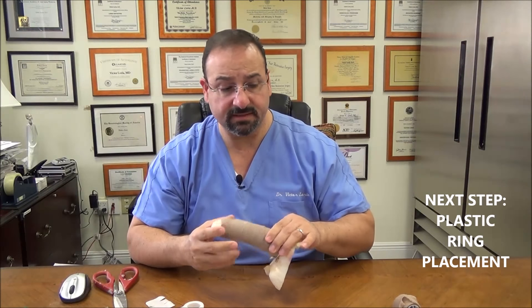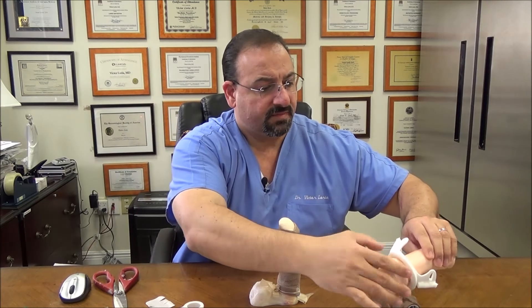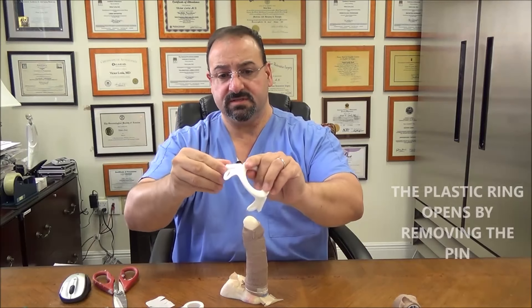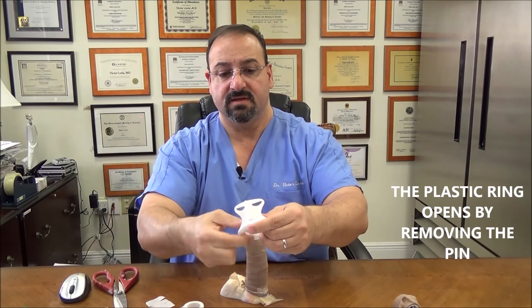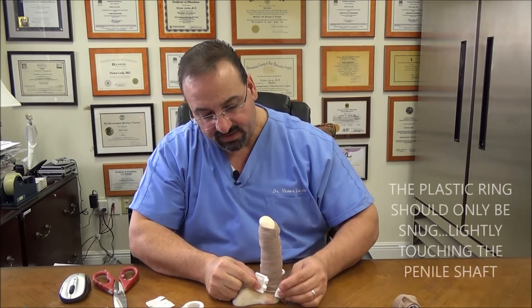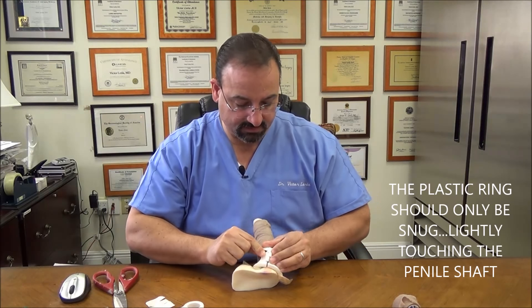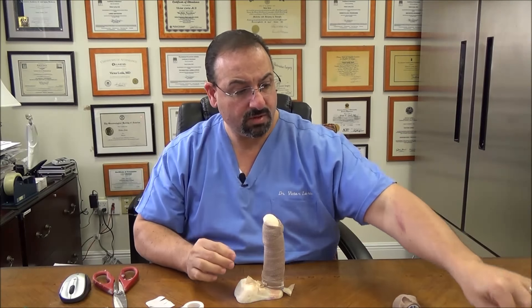The next step is plastic ring placement. The plastic ring is basically this device — it opens, and this is important for you to remember. You have to look for the joint, there's a little pin, and it opens like this. It closes down on the base and should only be snug on the base. I want to show you how the ring goes on with the strap mechanism.